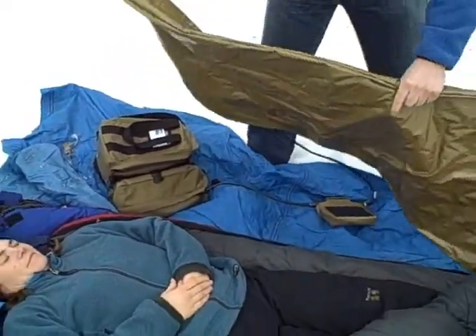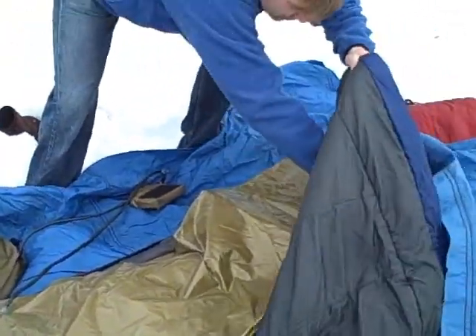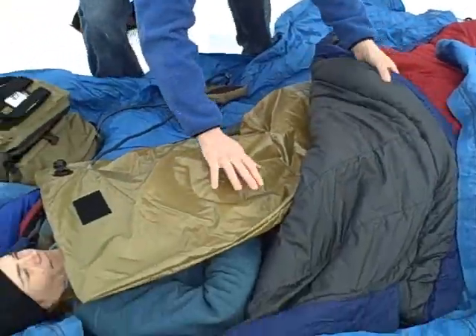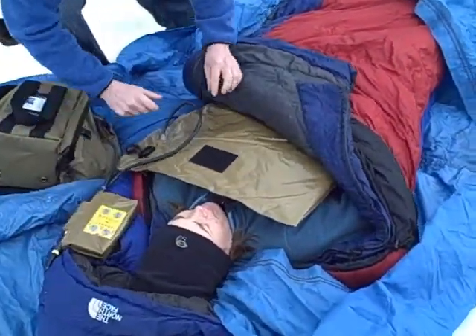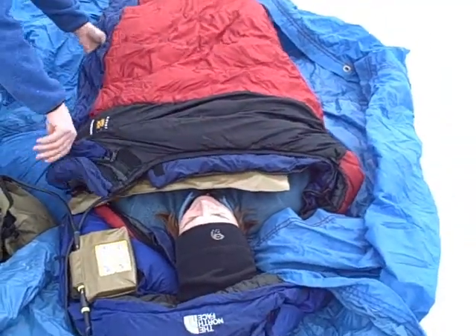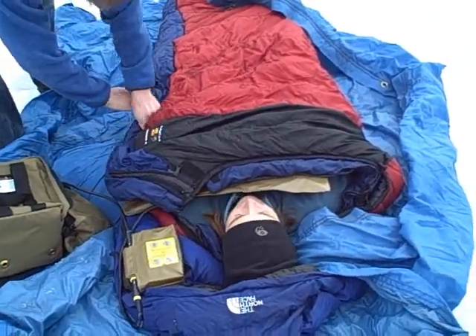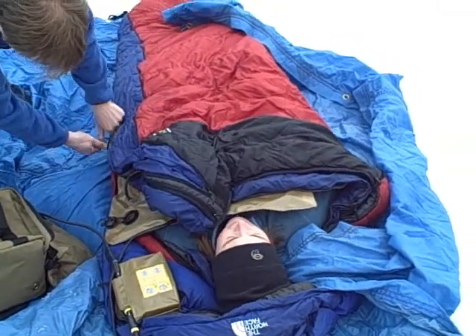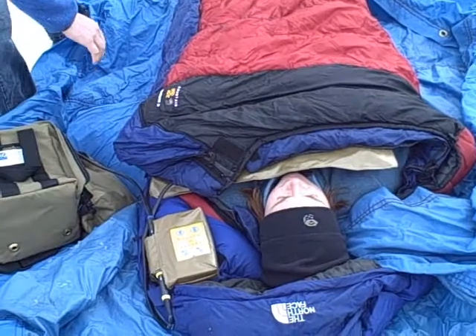Right now we're running off battery power. It's set to go to 105 degrees Fahrenheit. Amanda's just going to have that on top of her, and then Kevin's going to zip that in. The nice thing about this device is it's going to continue to generate heat, both to help our patient stay warm, re-warm her if she had a lower core temperature than normal, and it's portable.